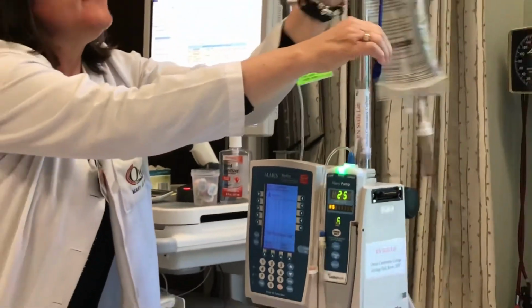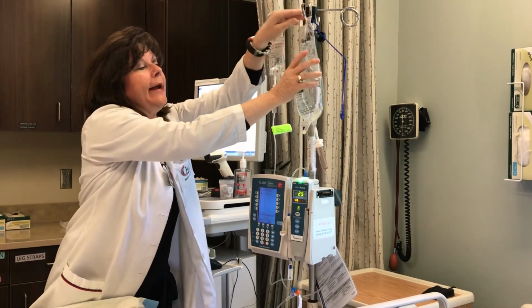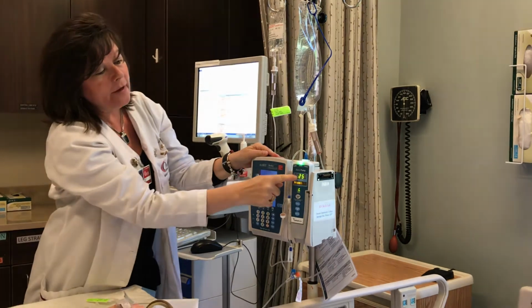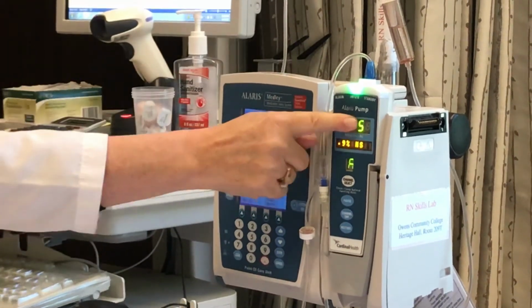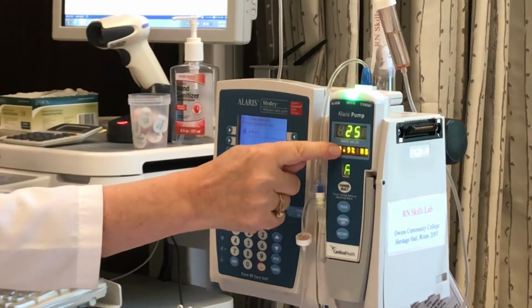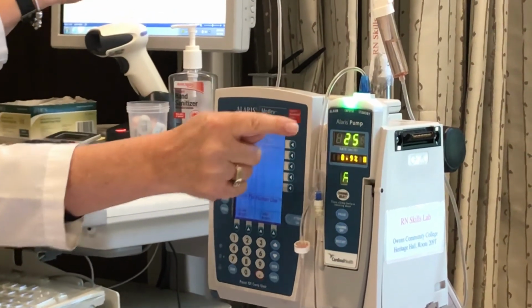I will raise my primary bag back up because remember I said I want the bag infusing to be the highest bag on the pole. And then I'm going to verify that it is running at 25 ml per hour, which is what my primary IV is ordered at. And the solution is 0.9 normal saline, and that is what is ordered on my MAR.